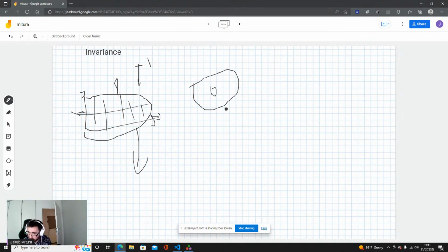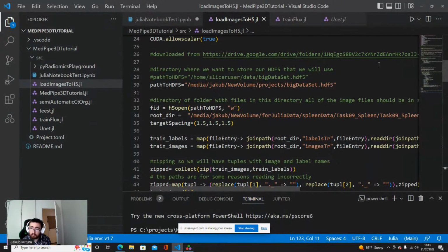So which augmentations exactly are good for each case depends on the problem. Some augmentations like translations are usually good, and usually the intensity transformations are good, but there is no one solution for all. It's problem dependent to a big extent. We want to synthesize data that is probable to happen in real life. Okay, this is the idea.